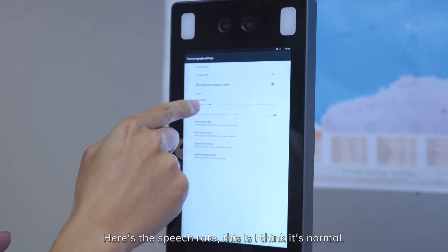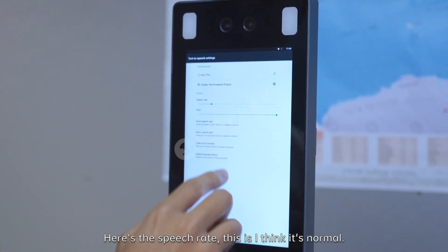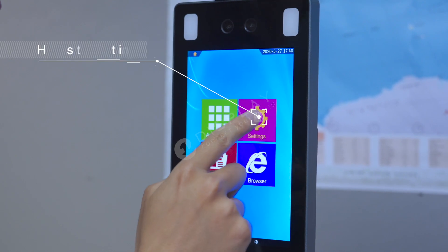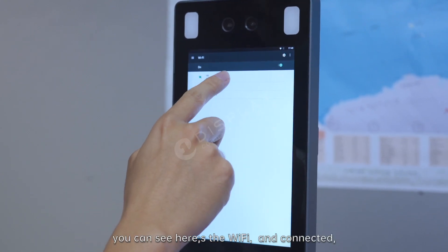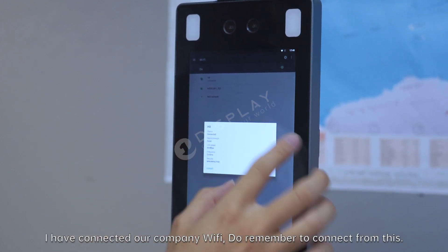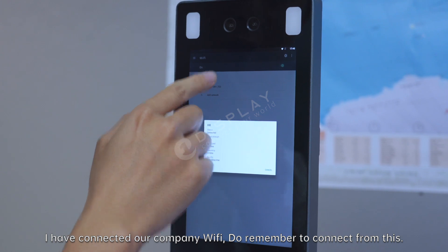Here is the speech rate, and I think this is normal. Here are the settings — you can see here is the Wi-Fi. Connect. I have connected our company Wi-Fi. Remember to connect from this.